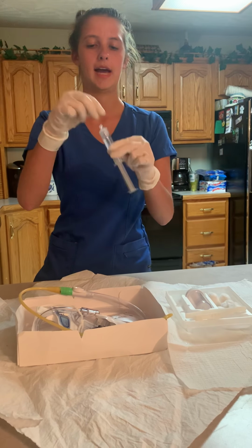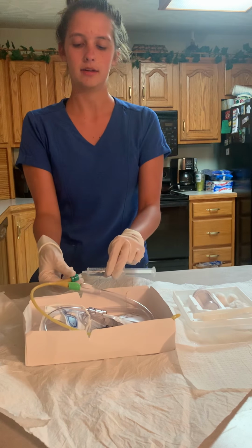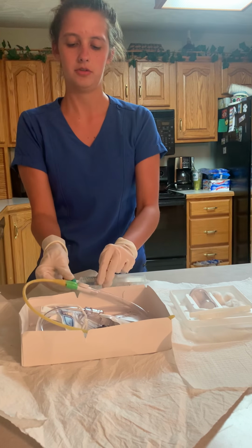I'm going to remove my cap. So we're going to go out and away from the sterile film. Then we're going to go ahead and attach our syringe there. So that's ready to go.